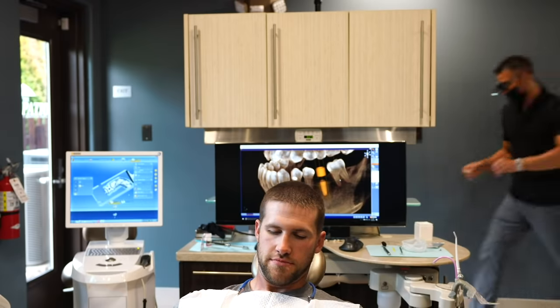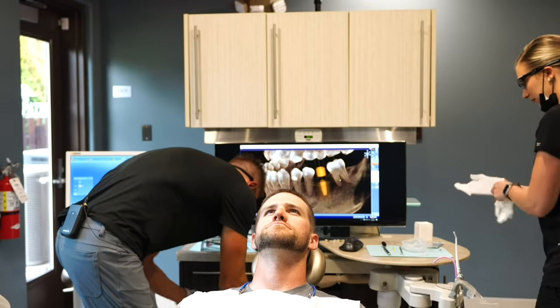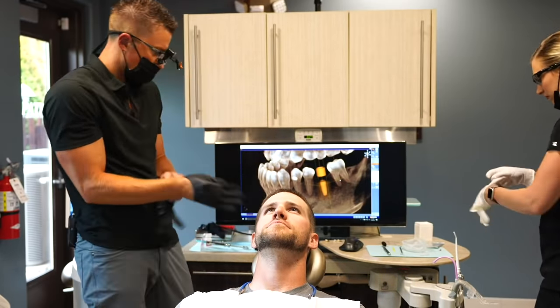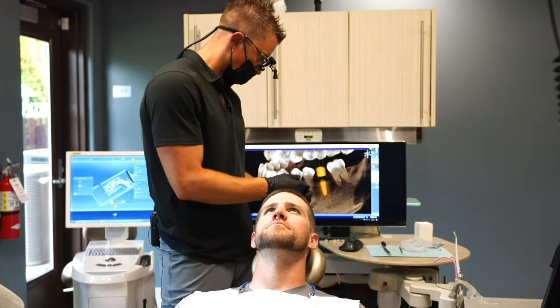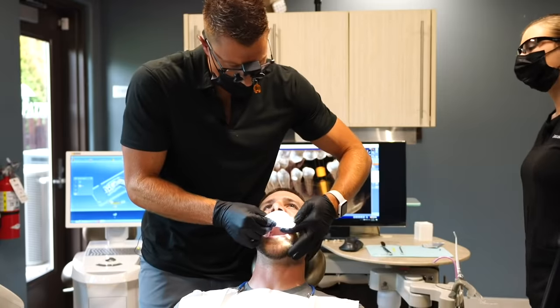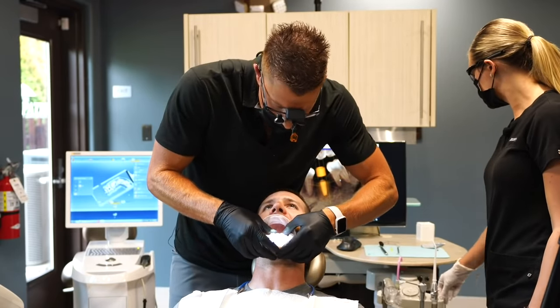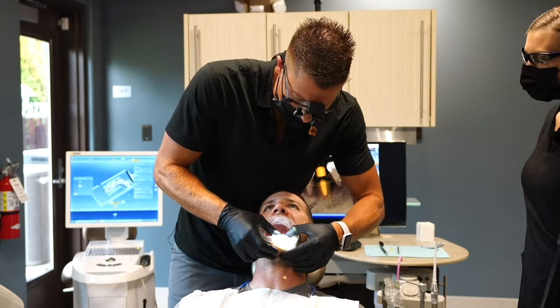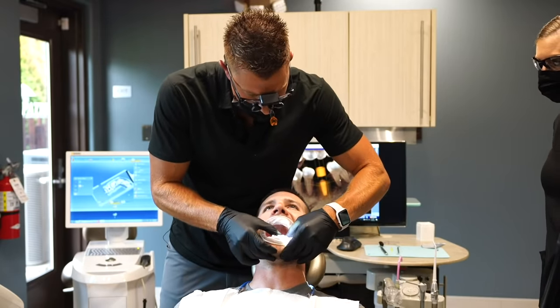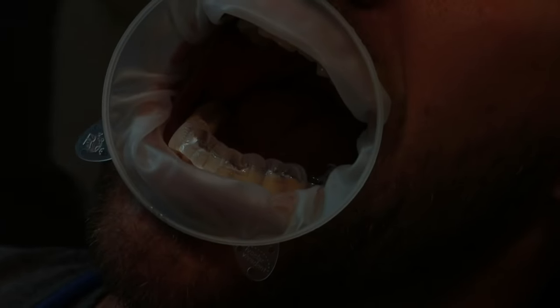All right, I am back. I'm going to rinse that off here. Thank you. So now you can see with those windows, Michael, if you can zoom in on that, you can see how this allows me to verify that our guide fits his teeth perfectly, and I can tell by putting pressure here that it doesn't rock at all. It's a tough crowd.